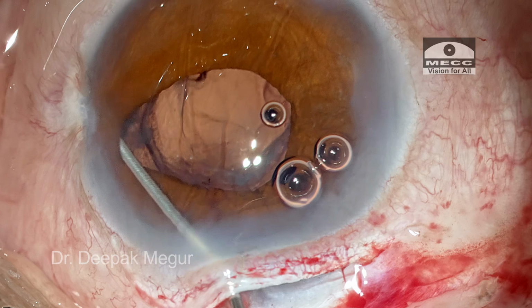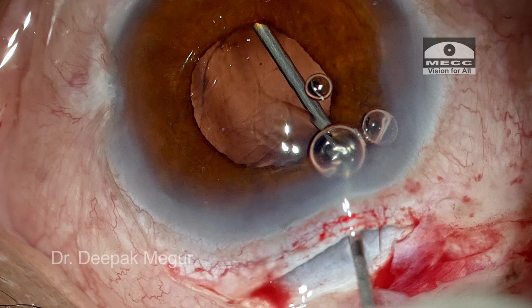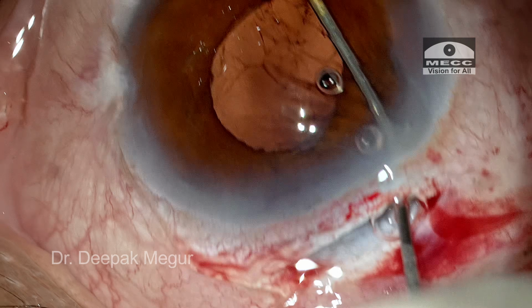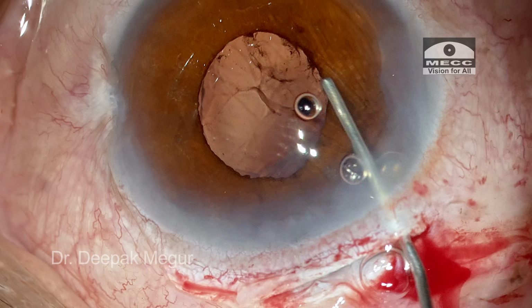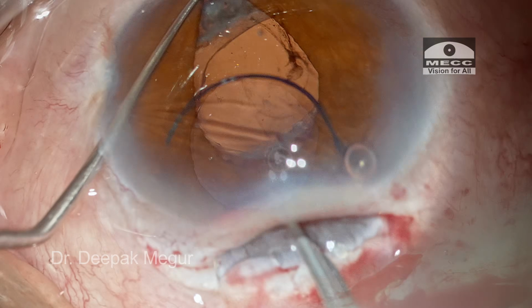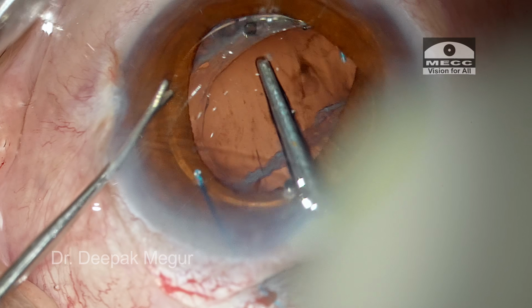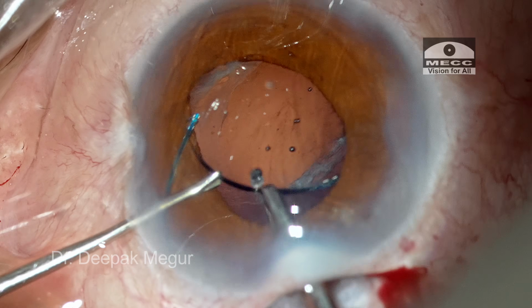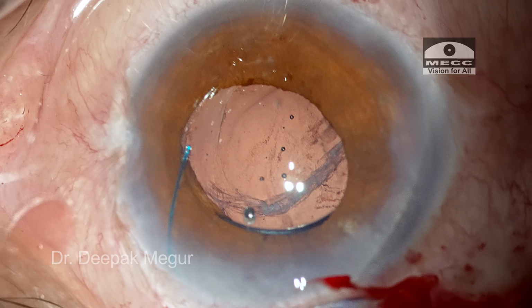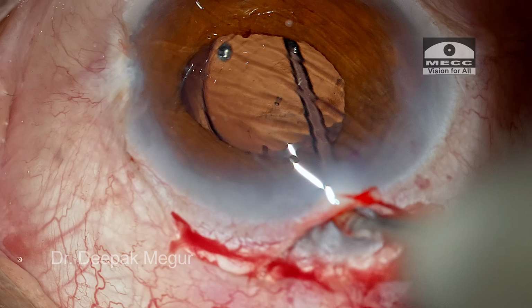Mind you, the moment we inject OVD, everything goes into the vitreous cavity because the posterior capsule is open. But still, this OVD is slightly better and it retains the space for a good enough time for us to navigate the lens into the sulcus. I'm using the second instrument to retract the iris so that I can see where my distal haptic is going in, and the first haptic goes in and the second haptic again I'm dialing in.